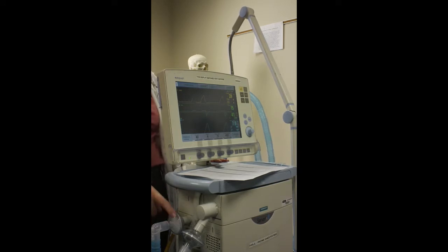So exhaled tidal volume, if this is low, it's because something happened along the way that the air didn't get to the patient. It could be something in the circuit. It could be something with the ET tube. So exhaled tidal volume is a direct measurement of are we delivering the volume that we want to give. It's one of the most important numbers that we look at on a vent. Because if we're not delivering our volume, what will that affect?